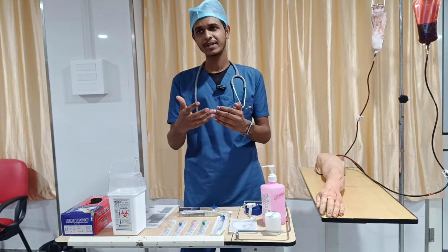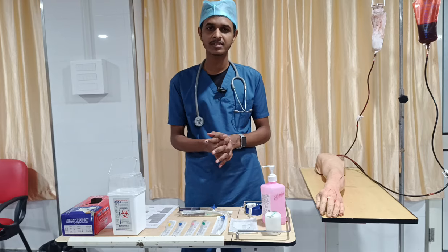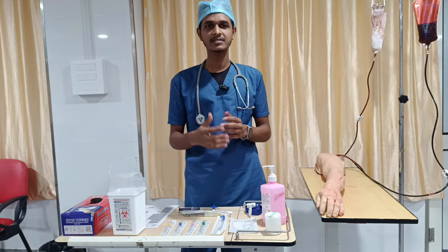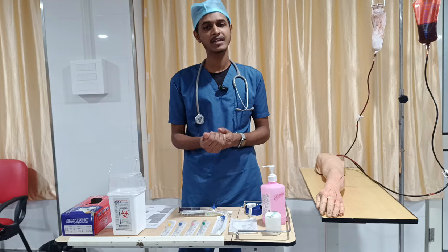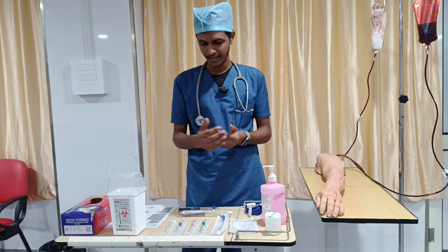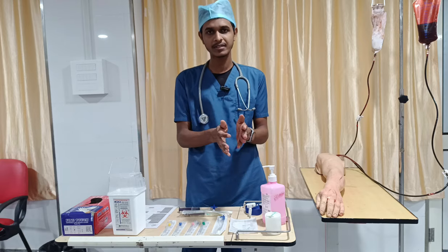We have to explain the purpose, why we are going to do the IV cannulation, what risks are associated with it, and what benefits the person will get. Finally, what alternative techniques we have. Those are the things that come under the informed consent you have to take. And then finally we ask the aide to prepare the things, right?